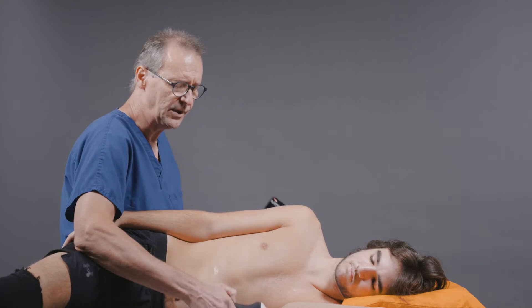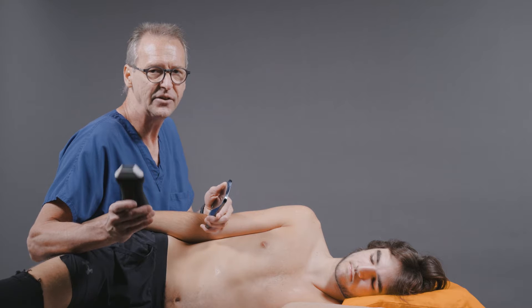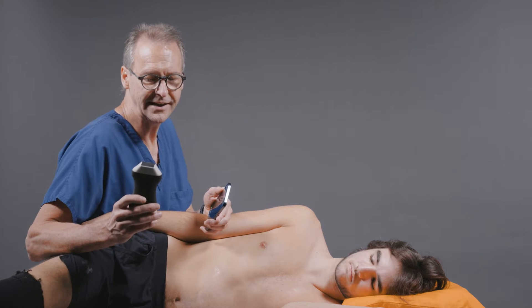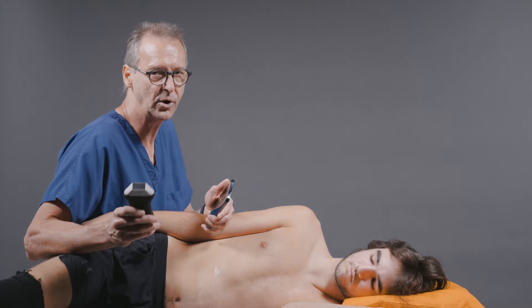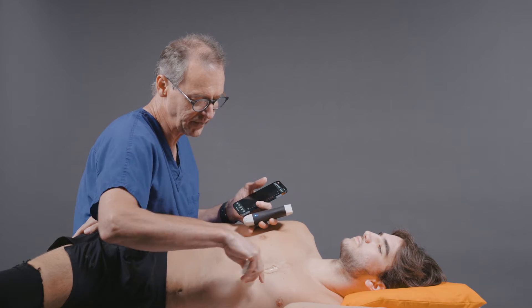Today we're going to use the new Clarius PALHD3 transducer. The acronym PAL stands for Phased Array and Linear Array, and it's a combination transducer that allows you to examine almost the entire body with a single probe. We'll get started with the FATE exam by looking at the parasternal long axis views.